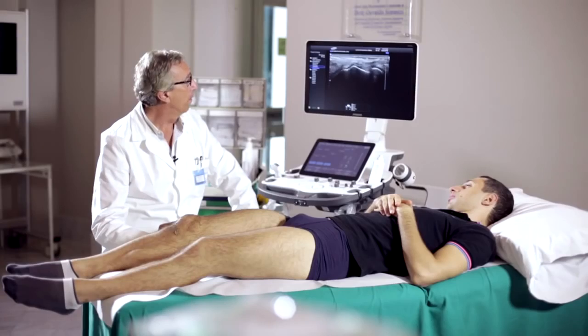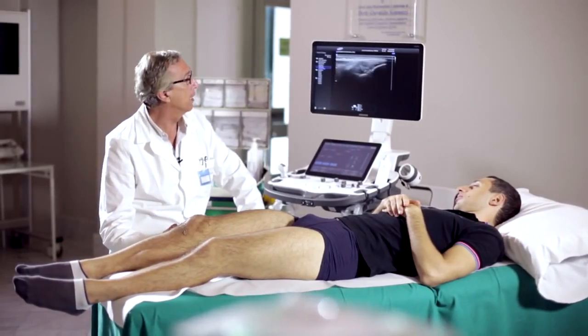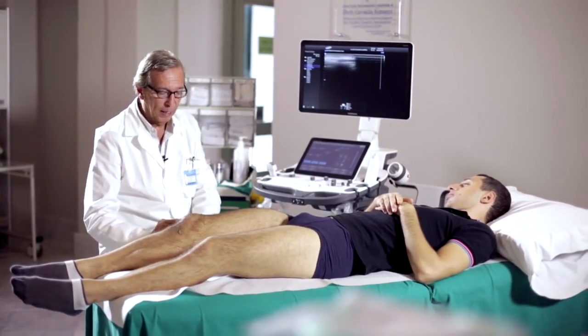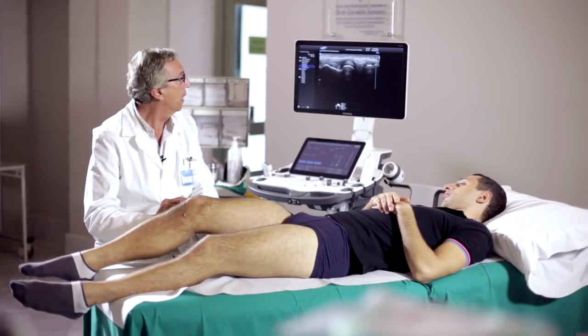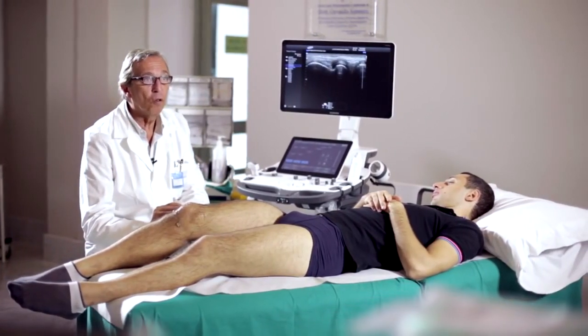This tendon is examined up to the correspondence of its common insertion with the ligament at the level of the head of the fibula. The last thing to do is to evaluate the lateral collateral ligament, which is highlighted by flexing the knee a little more.